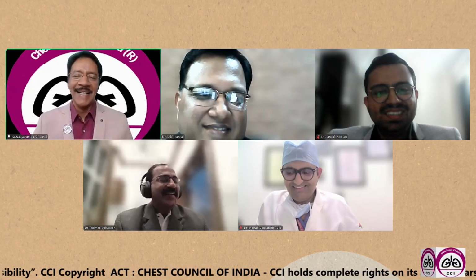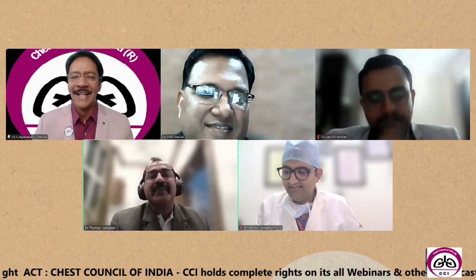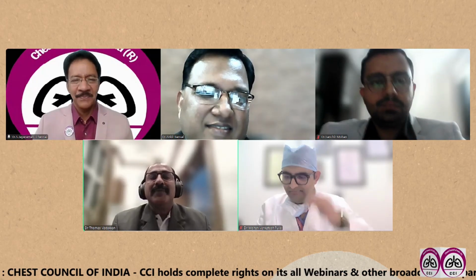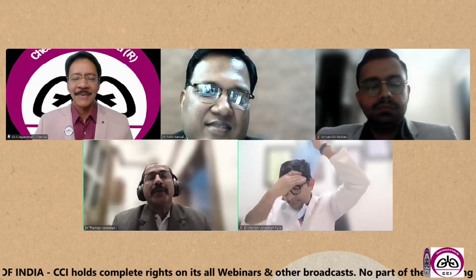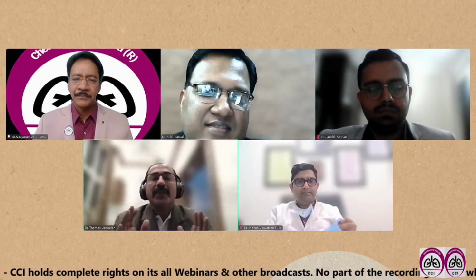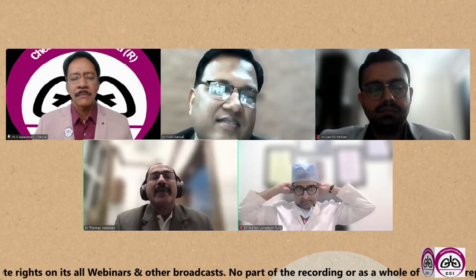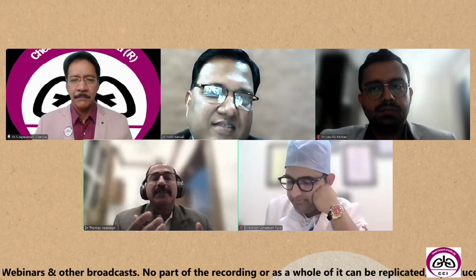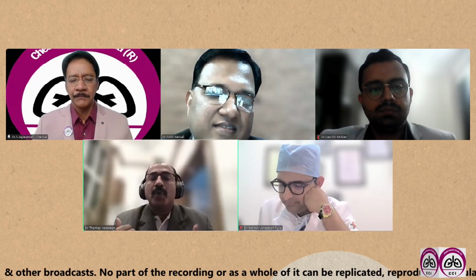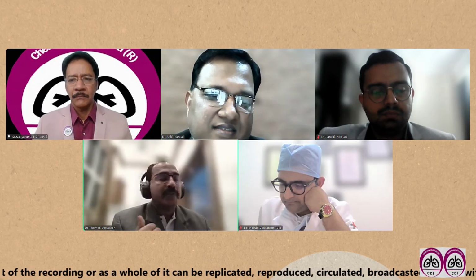So yes, bleeding is one of the most common complications which we come across, but with training we can substantially reduce it. The 4 important points I want to discuss here: know the patient is the first thing. So we routinely do the coagulation workup. And in some cases, in a real emergency, we may have to proceed with EBUS though they are on double antiplatelet. In that case, we can arrange 2-3 platelet transfusions prior to our procedure.